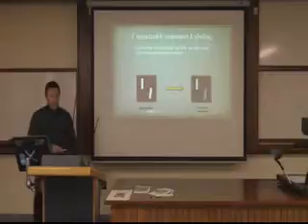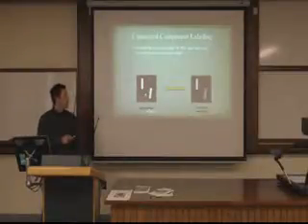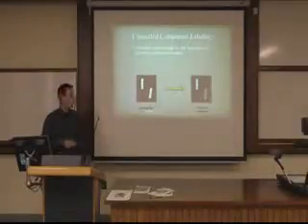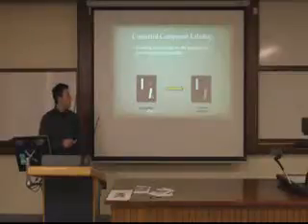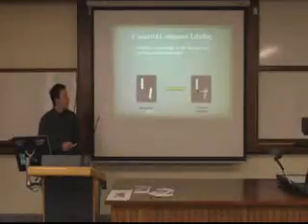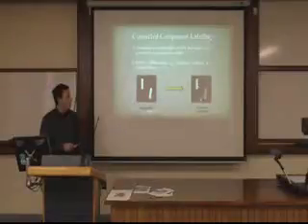And so after I've got my binarized region of interest, because you never know what you're going to end up with, you might have multiple markers within the image, or you might have some segmented background. So to further differentiate what these will entail, you apply connected component analysis, which basically turns the black and white binarized image into black and then shades of grey. Each component gets its own label, and that helps differentiate what's within your ROI.